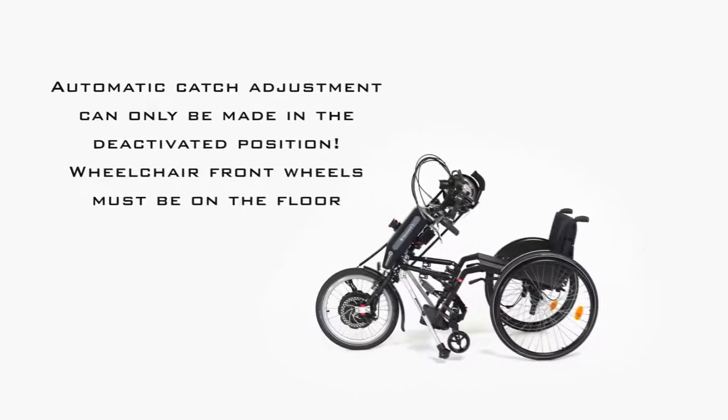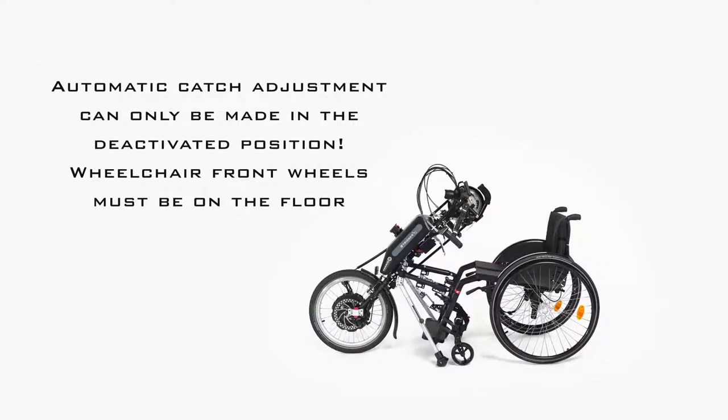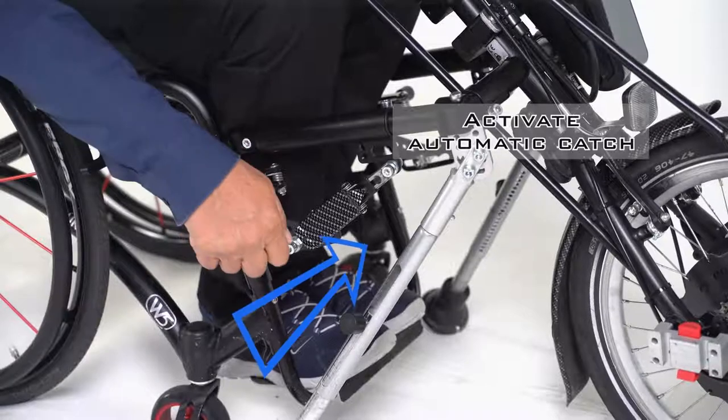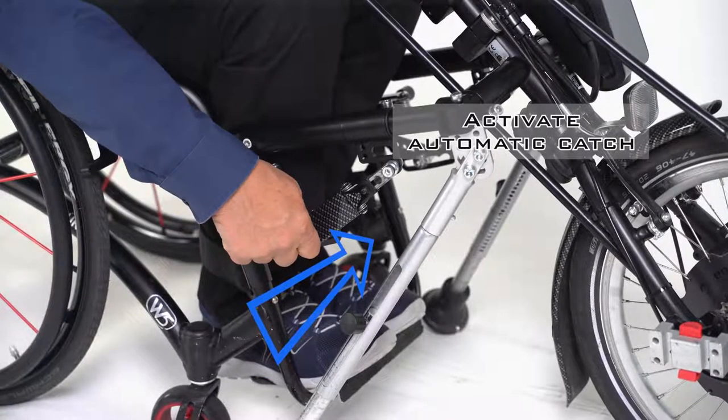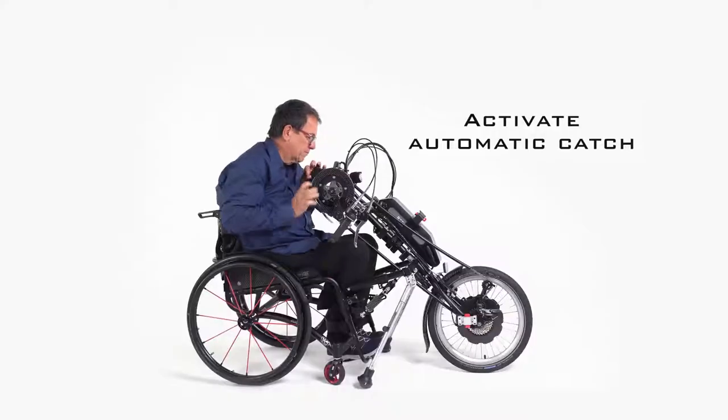The optimum height depends on the quality of the road surface as well as the area of use. When adjusting, make sure that the automatic catch is deactivated and that the front wheels of the wheelchair are on the ground. To activate the automatic catch, press on the cover and push it upwards until it locks into place. Repeat this on the other side.